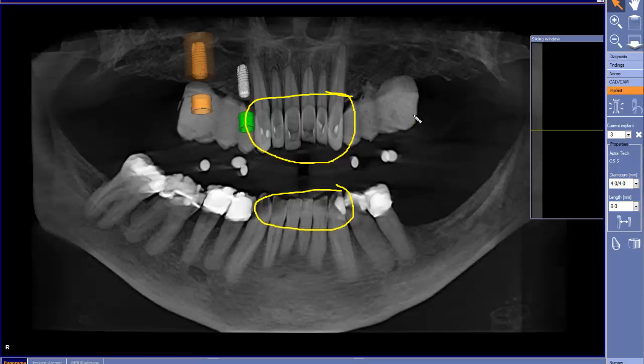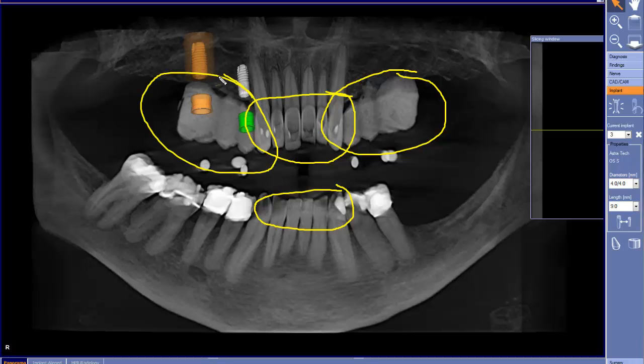Now, when we look at opti guide, we need to look at a couple of things. Are we going to do a simple opti guide? In other words, replacing one or two teeth, place some bite registration in the bite plate, and place it over the teeth. Or are we going to do what has been done here, where we have a radiographic surgical stent made with the teeth and barium sulfate, with the surgical bite plate bonded to the surgical template, and then scan in the mouth.